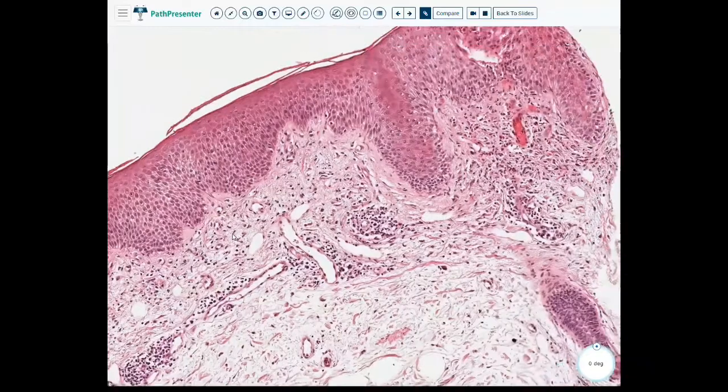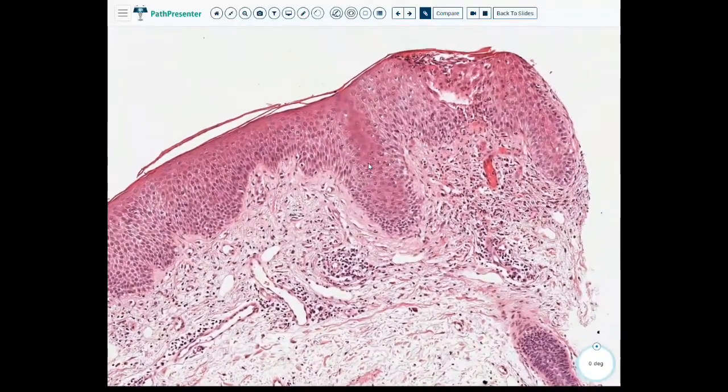So remember in the lecture, we had the photo of the child that had the perioral erythema. So again, these are really common to see, like within the elbows or anywhere on the skin, but they're reactive. And remember that these patients will have chronic flares, so they need to try and keep the skin moist and avoid stressors that can cause them to have outbreaks of eczema.